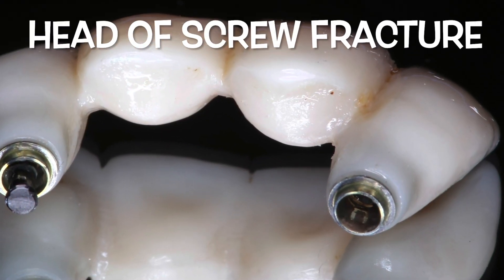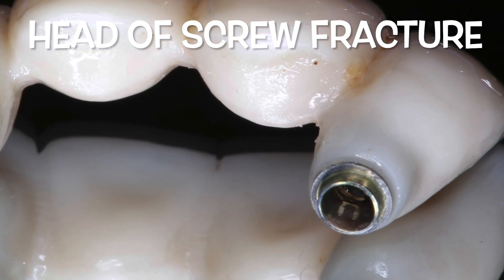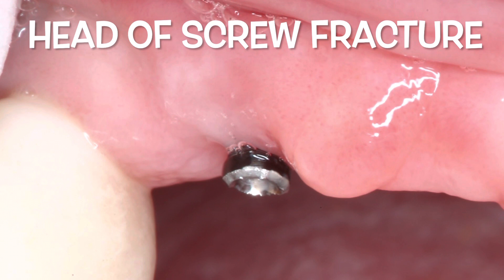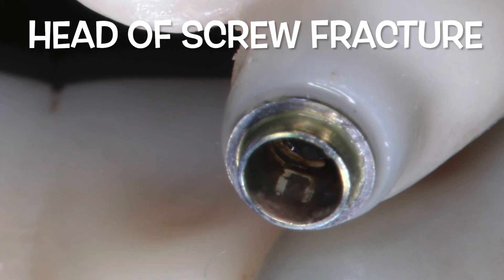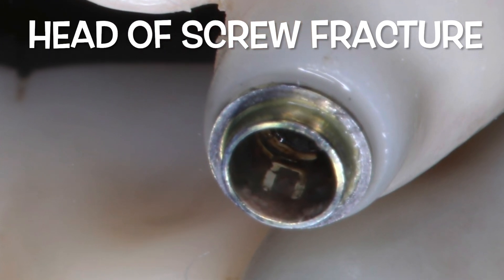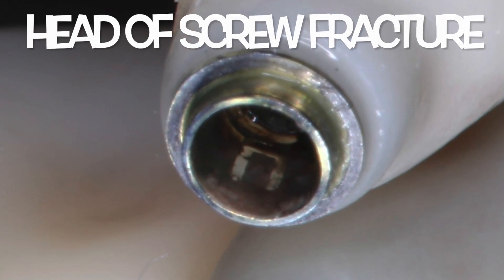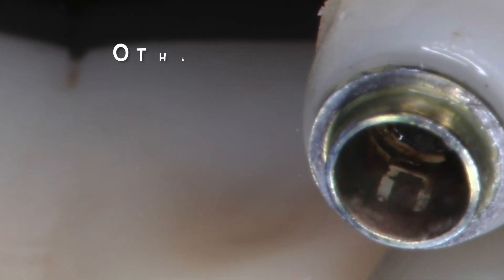Looking at the first side, we can see that this is the one where the screw head popped off — the screw is sticking through the tissue. Notice the wear and tear on the abutment itself; it's a titanium abutment and there has been some movement. This is how you know that the screw could possibly fracture due to that movement.